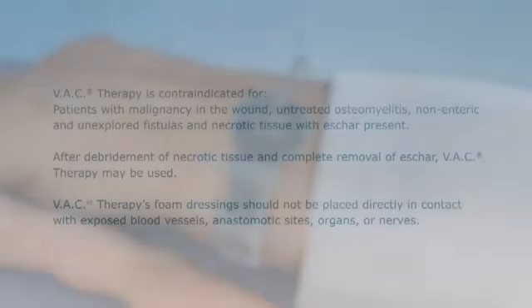Note: for vertical bridge placement on moderately to highly exudating wounds, the V.A.C GranuFoam Bridge XG dressing should not be used with V.A.C therapy pressure settings below -125 millimeters of mercury.